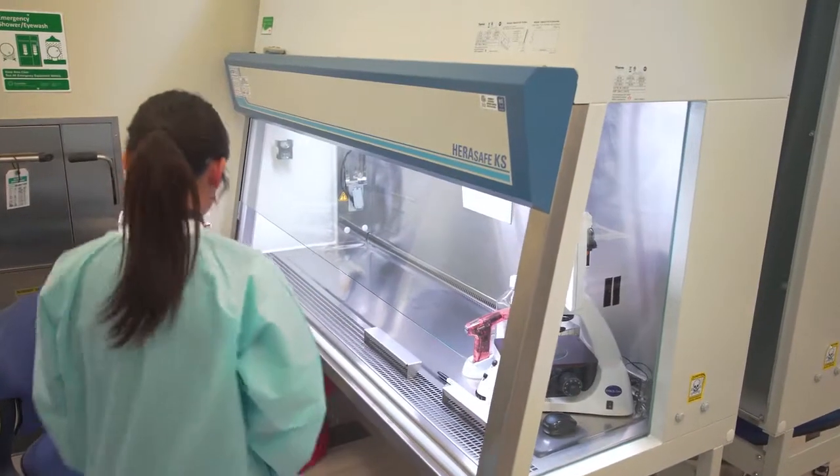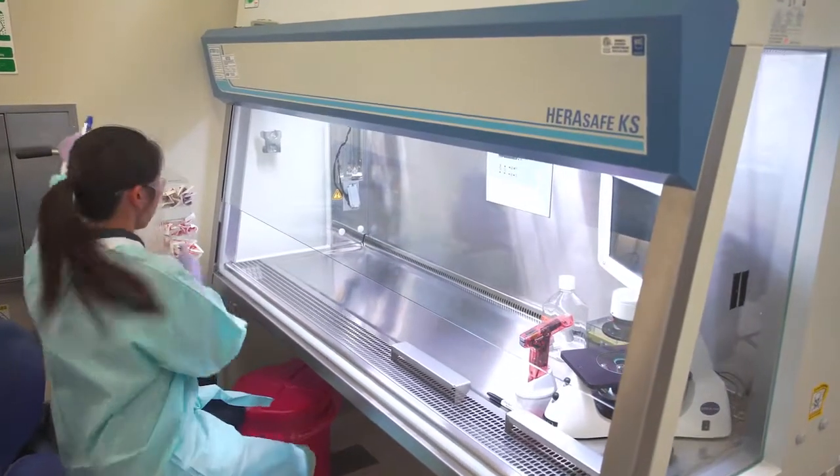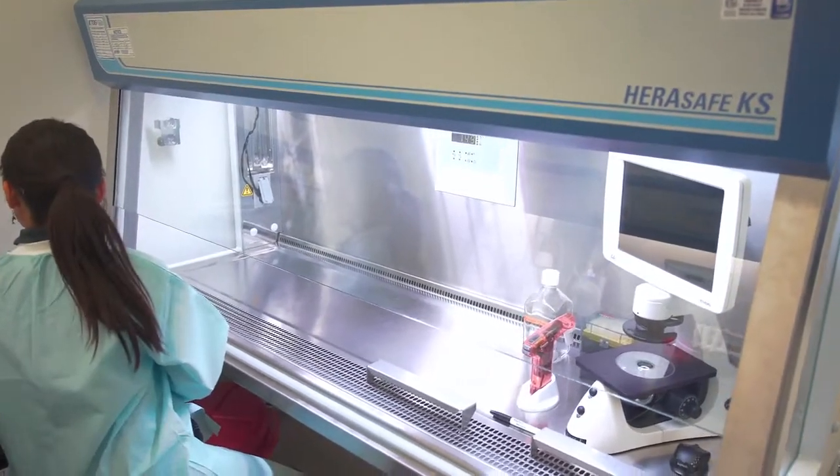Successful cell culture depends heavily on keeping the cells free from microorganism contamination. This can be accomplished with proper knowledge of sterile environments, working slowly and deliberately, and following all of the guidelines for sterile technique.